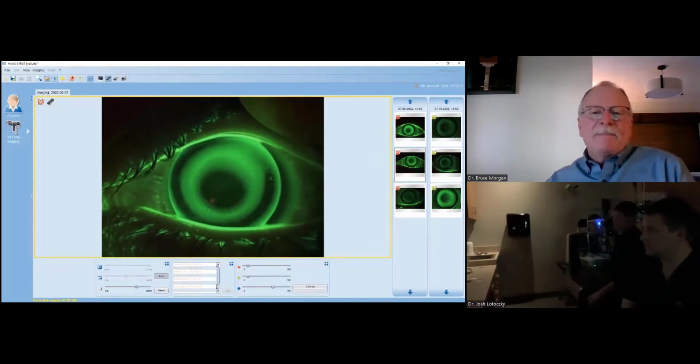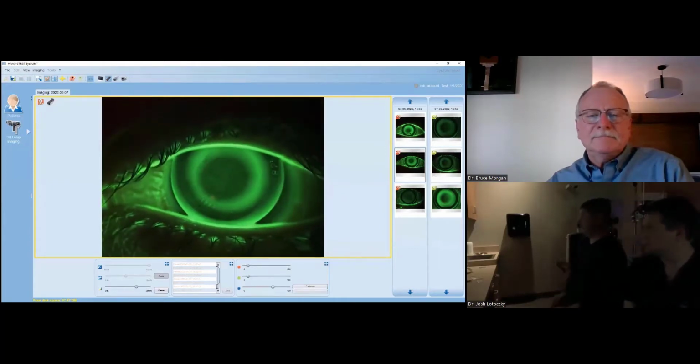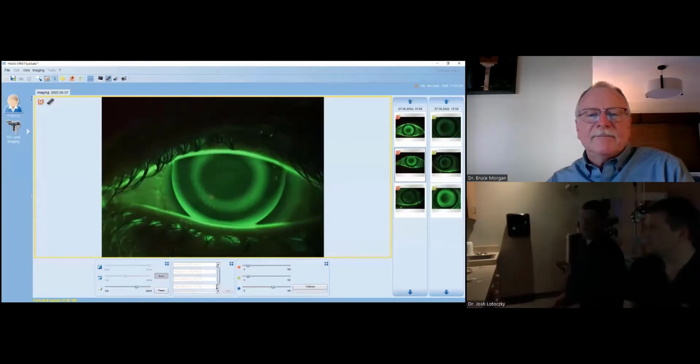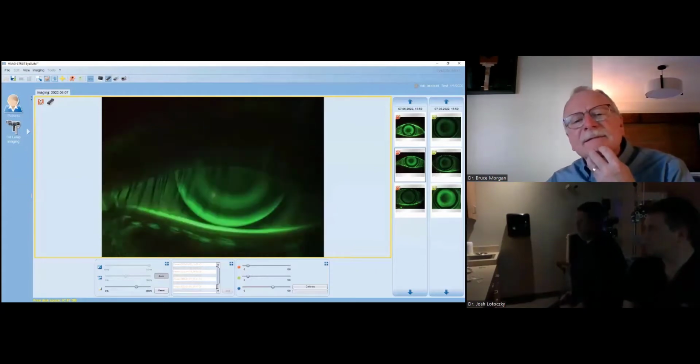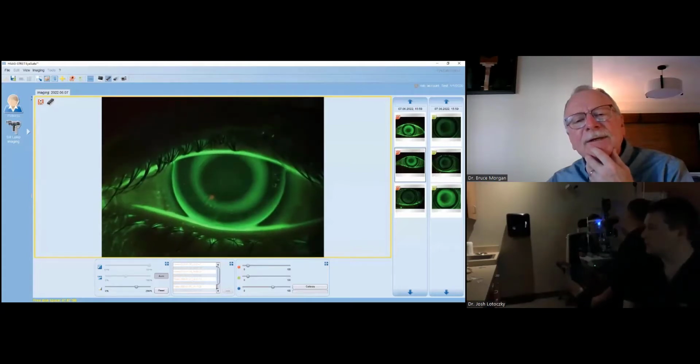But to me, we've been focusing more on trouble within the treatment portion. This one seems to have a little bit more trouble between the return and the landing. Every now and then you get a little bleed through again. This doesn't look bad, but that's the difference I see between this lens and the previous ones we have been seeing. Yes. And when you center it, you definitely see a little bit more of that oval looking treatment zone.